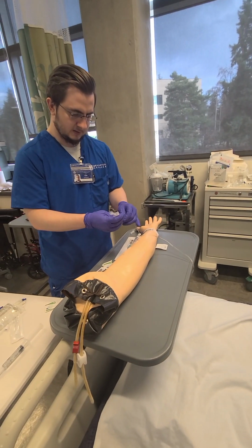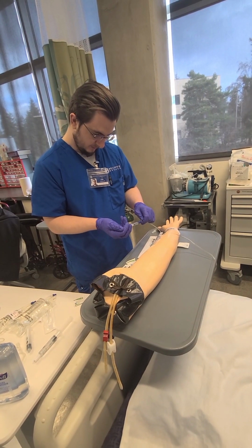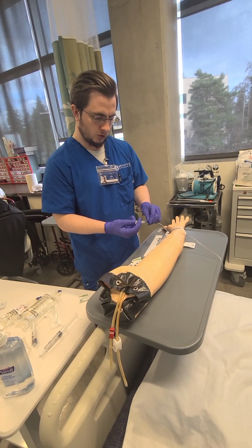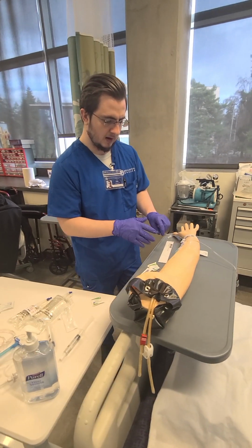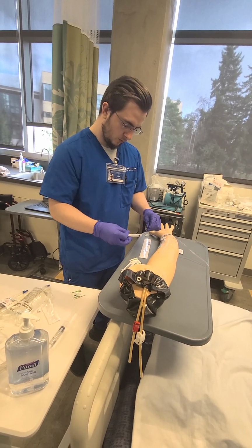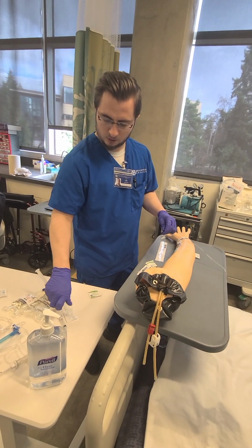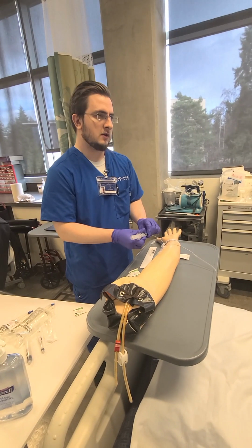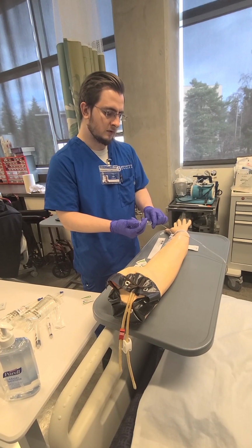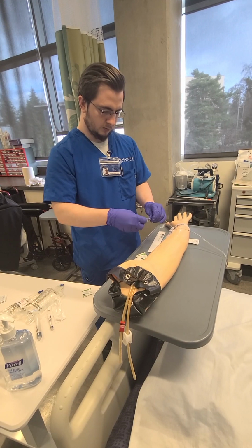All right, ready? This is pushed over 2 minutes, so I do my first milliliter over a minute, and then my second milliliter over the next minute, making sure there's no pain or anything while it's getting pushed through. Ask Erica, are you all right? Does it hurt? Anything abnormal? Good. Then flush it one more time to make sure that the line is clear. Flush it my last time. And we're good.